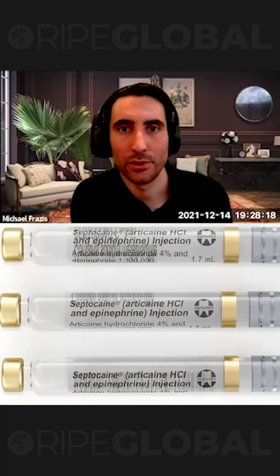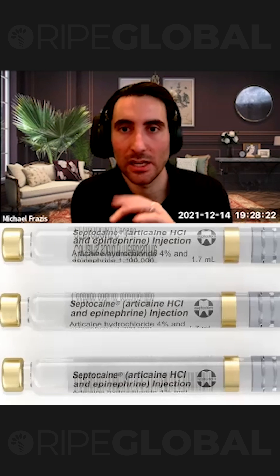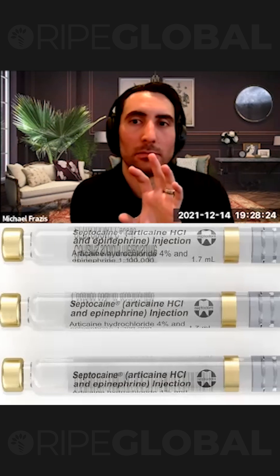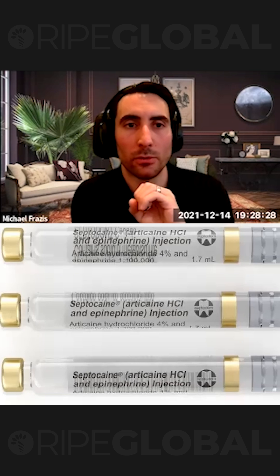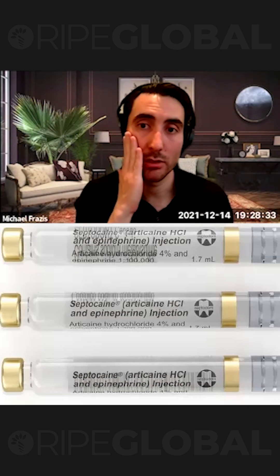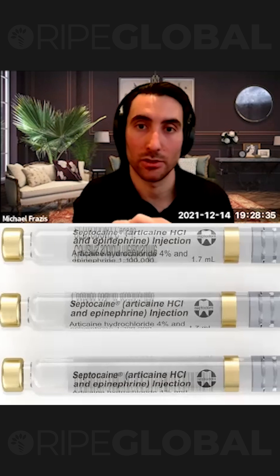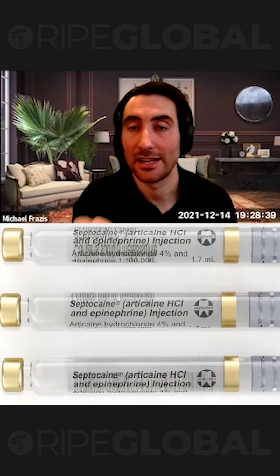For an upper tooth, I will use articaine. You can see the one that I use there — it's 4% articaine with adrenaline, or epinephrine for those in America. I will do a buccal infiltration and a palatal infiltration, and then I wait and I test.